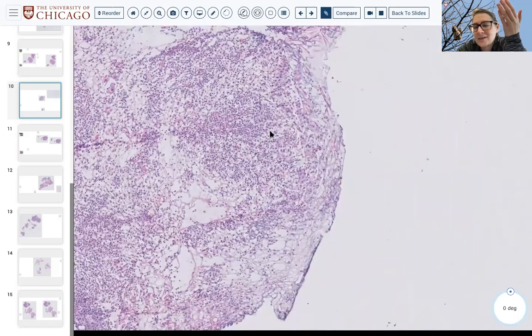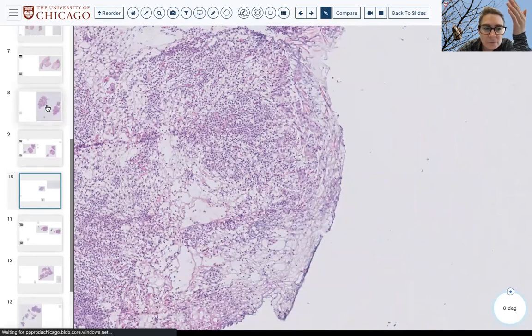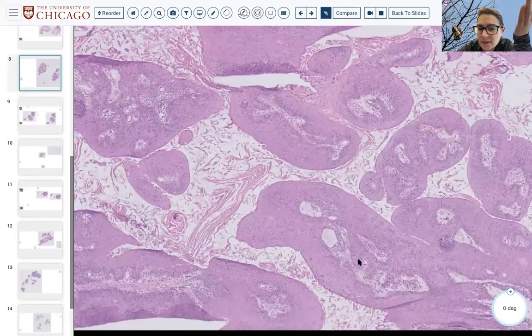And it's random, like single cells floating in the middle of inflammatory debris. So this was the invasive component of this, which we just saw, right? This exophytic papillary tumor was a really nasty tumor, even though it was histologically very well differentiated, okay? So I'll send you this.